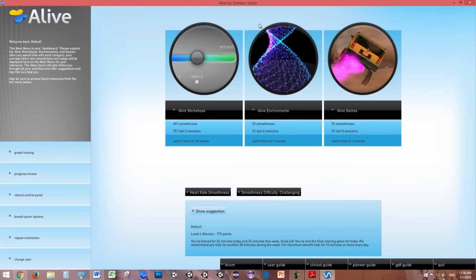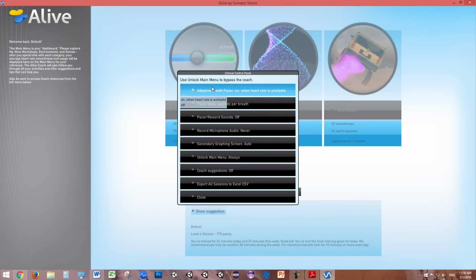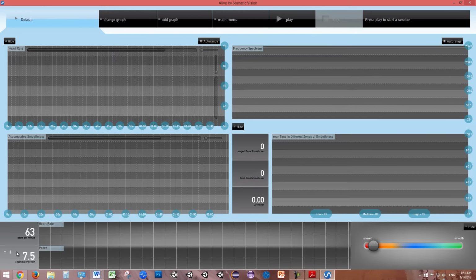From the main menu, you can now also open the clinical control panel and choose whether or not to use the adaptive pacer. The adaptive pacer responds to your heart rate increases and decreases, synchronizing the pacer to your heart rate changes. When the adaptive pacer is off, you can change the pacer speed using the plus or minus buttons in the breath pacer area.